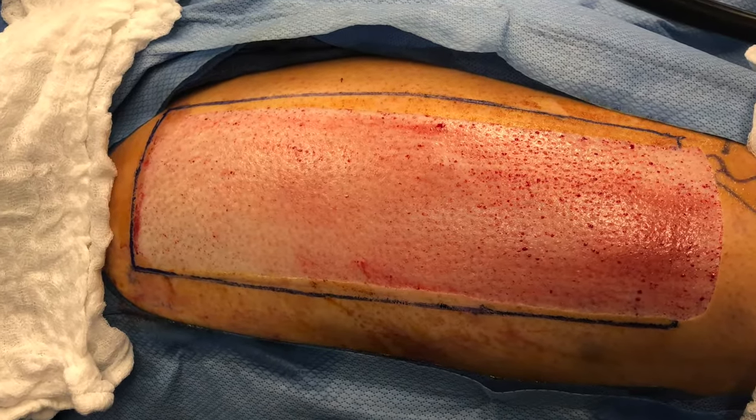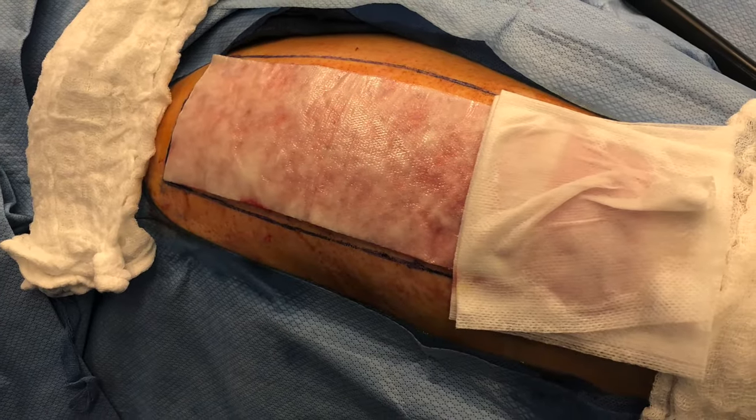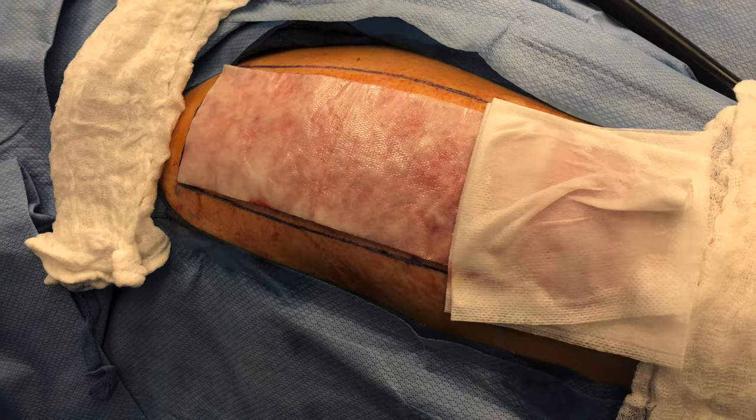Now that we've harvested our skin graft, the donor site should look like this. I cover it with the telfa soaked in lidocaine with epinephrine in order to minimize ongoing bleeding.